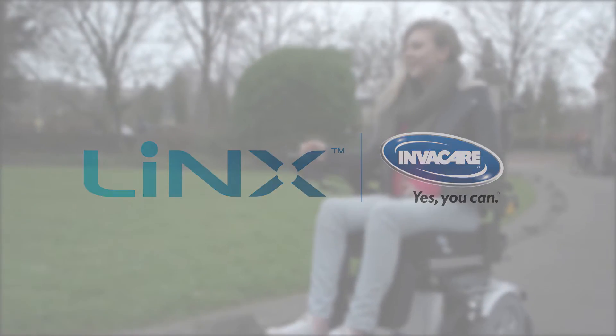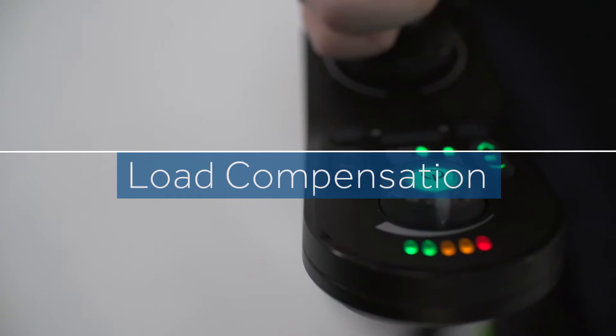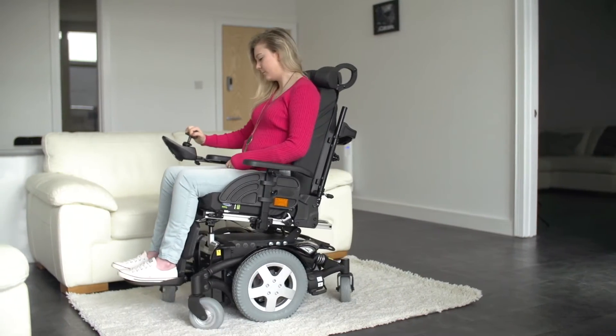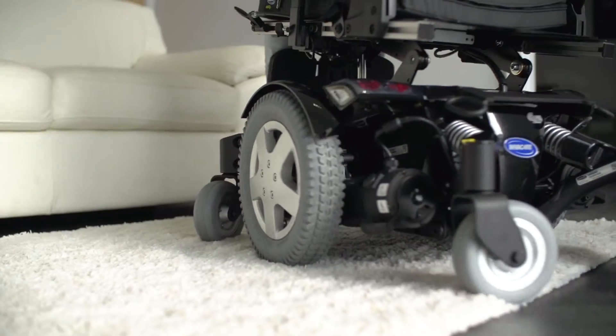What is dynamic and adaptive load compensation? Power chair users often have great difficulty when turning slowly on soft surfaces such as a rug. This results in the casters locking, followed by a sudden jolt when they finally release.